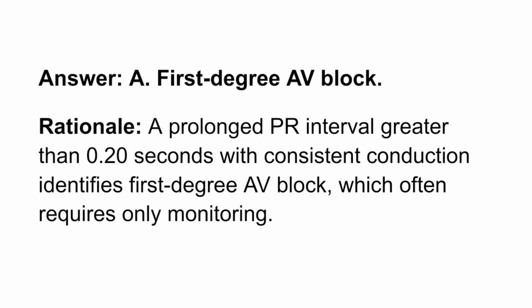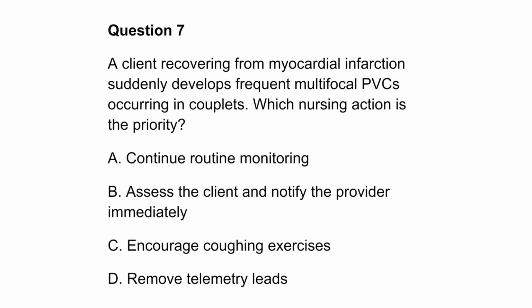Rationale: a prolonged PR interval greater than 0.20 seconds with consistent conduction identifies first-degree AV block, which often requires only monitoring. Question 7. A client recovering from myocardial infarction suddenly develops frequent multifocal PVCs occurring in couplets. Which nursing action is the priority? A. Continue routine monitoring.